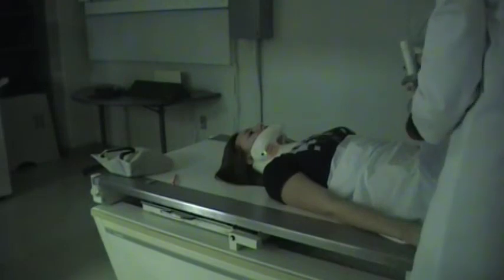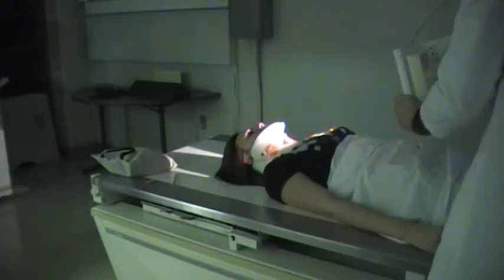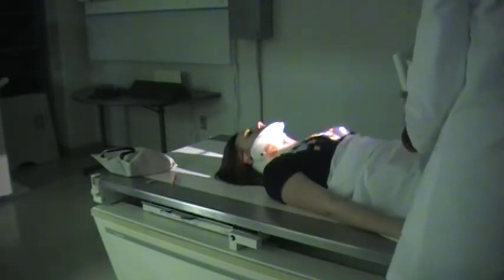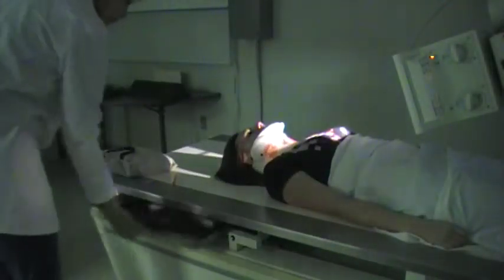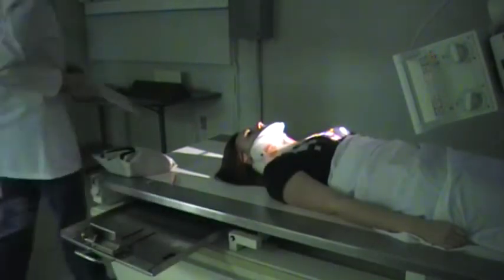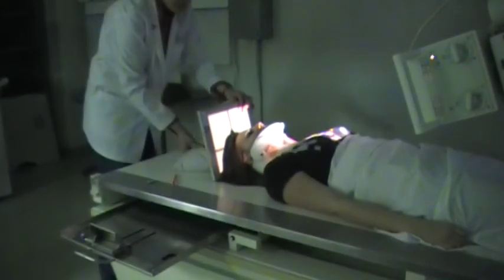Let your patient know you do have the x-ray tube close to their body. You don't need to try to bend their knees up. And I'm just going to angle down just a little bit more. This is pretty close to having the central ray perpendicular to the IOML. You know, you can't always get it exact when you're working with the trauma patient.